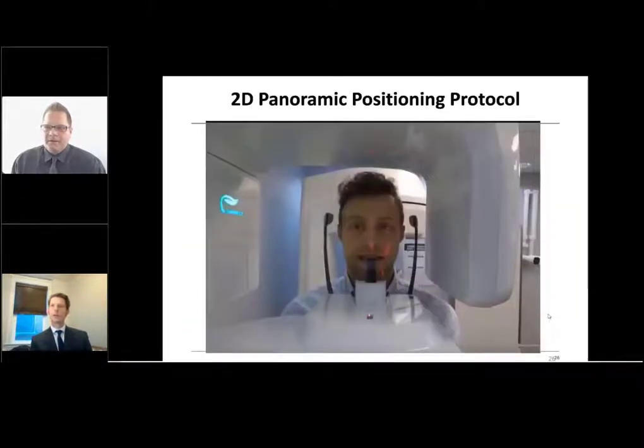So, Paul, you want to run through a summary here? Yeah, so just to summarize what Jim and I just described. We have our patient in the machine, they're biting on that chin rest, making sure they're biting in the grooves. First we'll take a look at the mid-sagittal light, running through the eyes and the philtrum. We want that line right down the center, making sure that's okay.